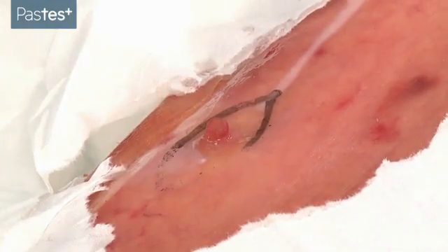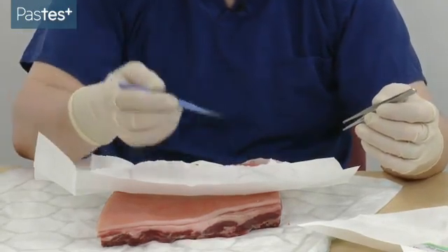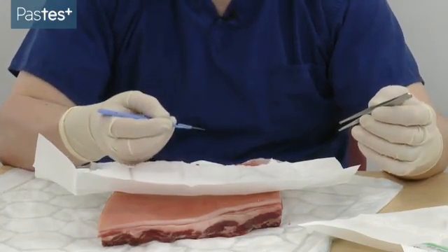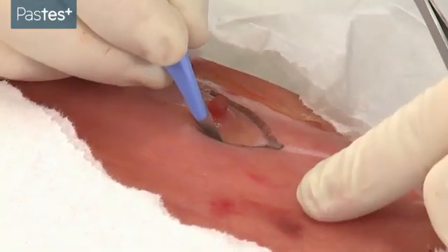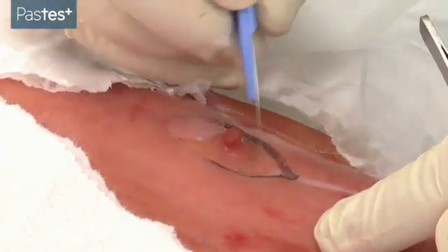You can now begin the procedure. The important thing is your sharps handling. There are two ways to hold a scalpel: either like a pen, or like this. For fine work, I recommend holding it like a pen.